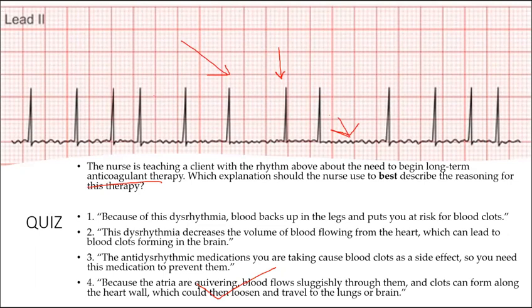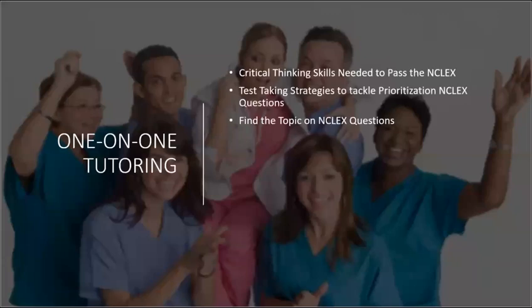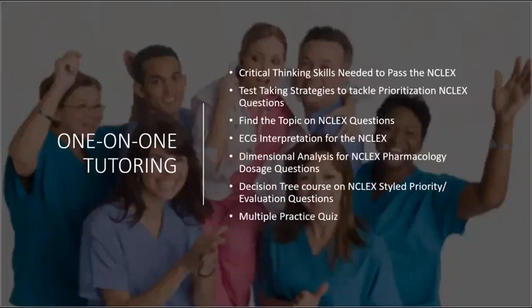Again, you don't need to cram all the ECG pictures. You need to understand the basics behind them. The exam is not a content exam, it's an interpretation and analysis based format. You need to understand all of this.